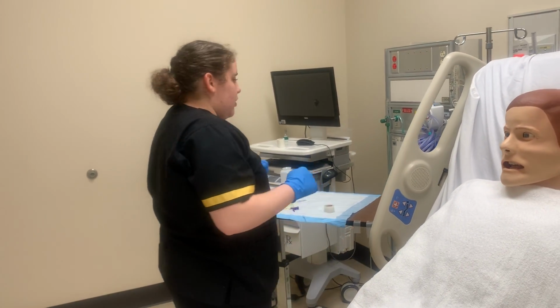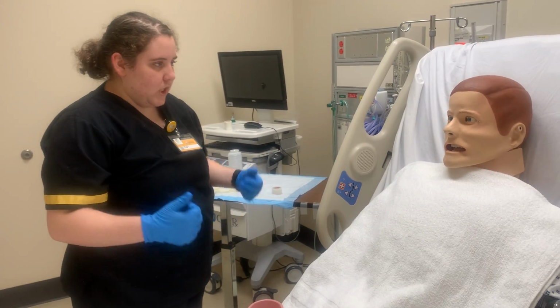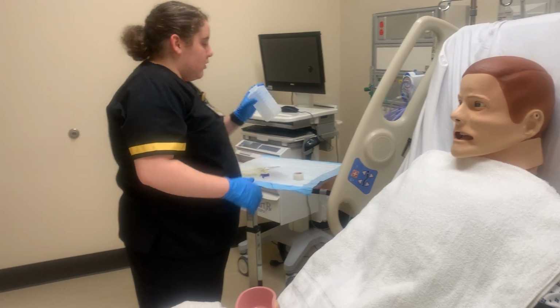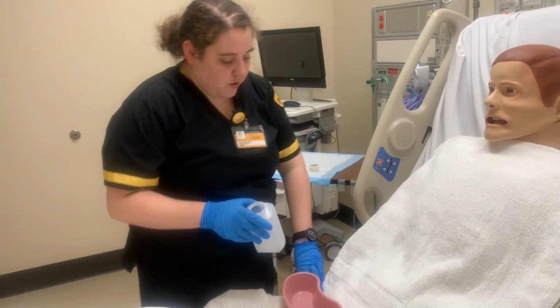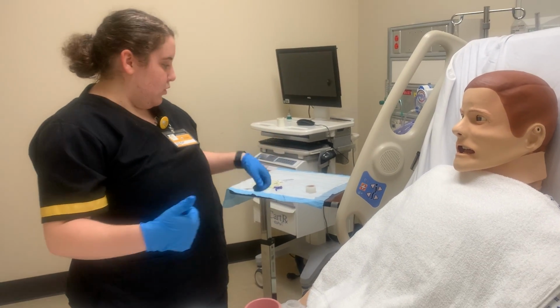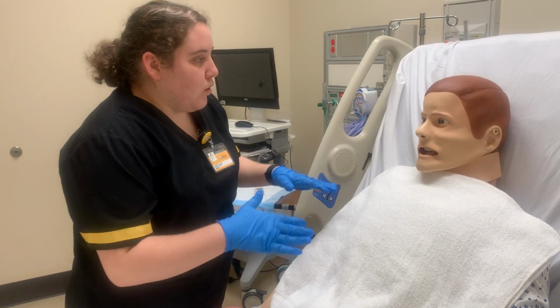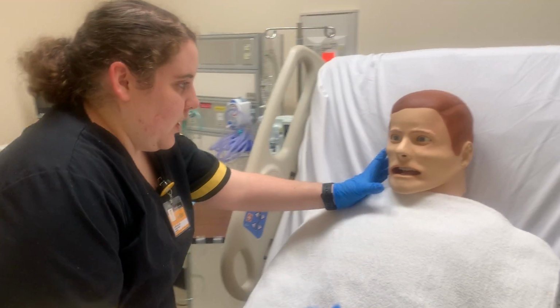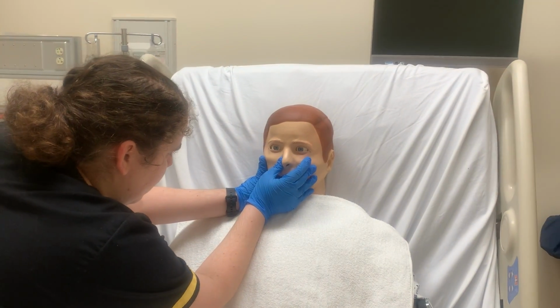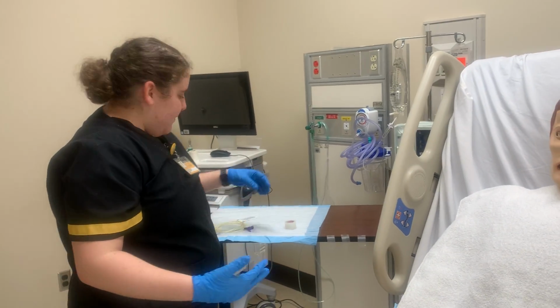Before I start, do you have any allergies or any past nasal surgeries that I should know about? Great. I also have this water here for you because there is going to come a point in the procedure where I need you to take a few sips. That way I can get the tube further down your throat. So before we get started, I'm going to check your nostrils to see which one is easier for you to breathe out of. So can you take a breath? And one more. Great. We're going to use your right one for the procedure because it came out better.